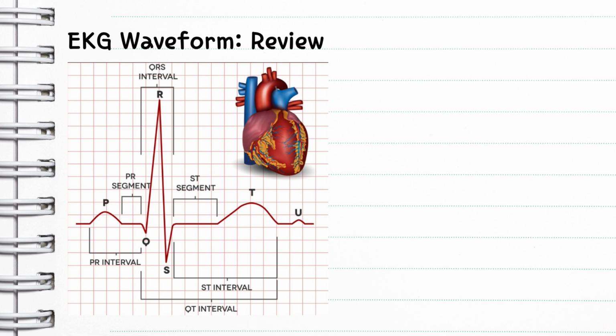So here's a reminder of the ECG waveform, a review. Okay, so when you're reviewing an EKG, an ECG waveform, you're looking at the heart's electrical activity displayed in a series of waves and intervals. Each part of the waveform corresponds with a specific phase of the heart's electrical cycle. So you already should know everything on this page, just FYI. This should be a straight up review, but I just want to go over it to make sure that we're all on the same page.